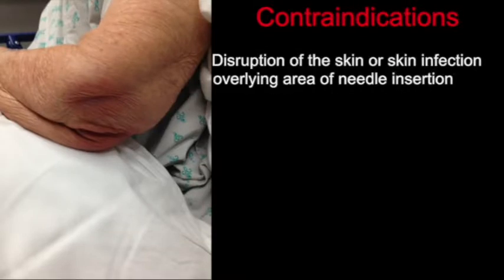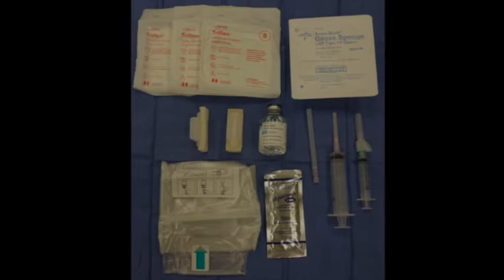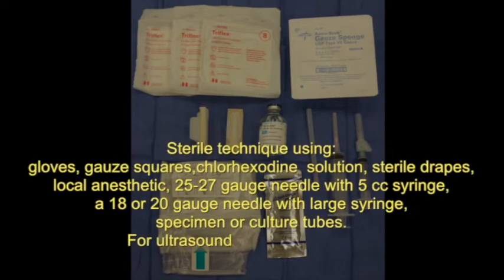Relative contraindications include disruption of the skin or the presence of a skin infection overlying the area where the needle would be placed, as this may increase the risk of introducing infection into the joint space. Presence of a coagulopathy is also a consideration, as it may increase bleeding within the joint. The procedure should be performed with sterile technique.